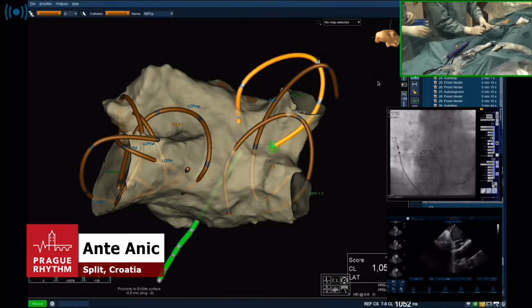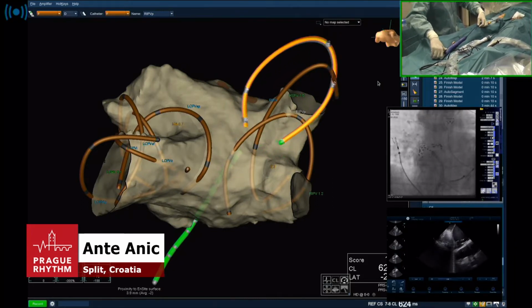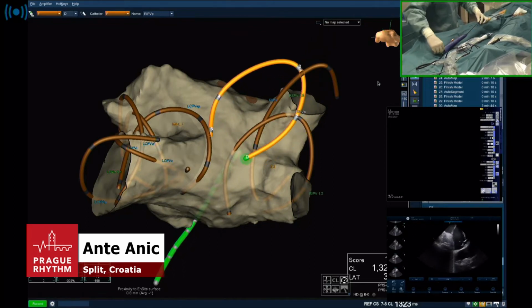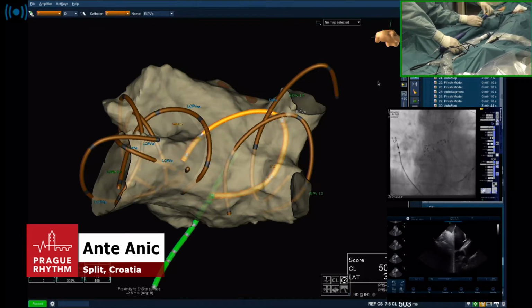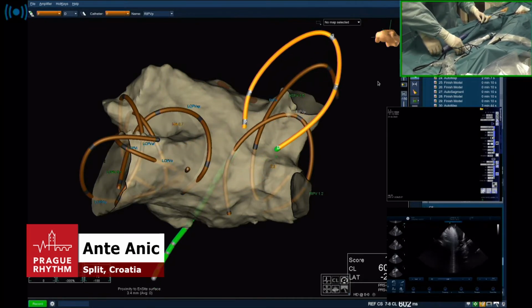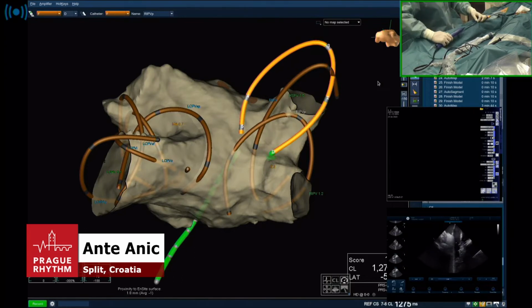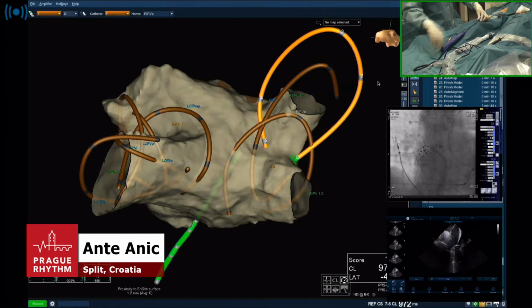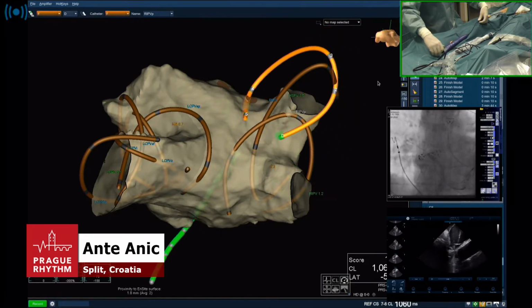This is still the inferior branch. This is superior vein. Yeah, I was able to get to that more anterior. There is a pulmonary artery, so this is superior vein. Predrag? Yeah. Maybe if you make a basket, you will go in. No. The trick is when I'm in a flower, I wanna get in the most superior branch, because we were able to do that before. Yeah, like this. Now you are there.